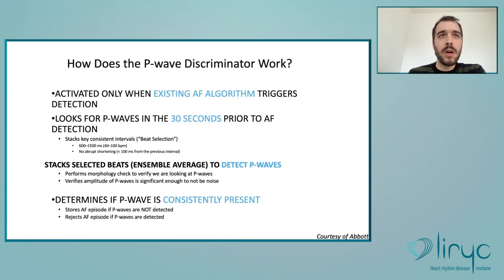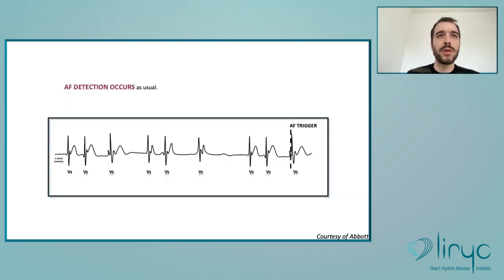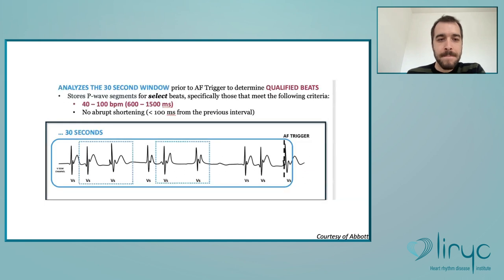So the P wave discriminator will be activated when there is a trigger for an AF episode, and it will look for P waves 30 seconds prior to AF detection. And what the device will do, it will stack select beats to detect the P wave, and it will determine if there is a pattern that is consistently present for the P wave. So I will show you an example. So for example, here, an AF detection occurs. The device will analyze the 30-second window prior to the AF trigger. So it will determine the qualified beats, and it will store a template, and it will stack all the templates of the P waves together.